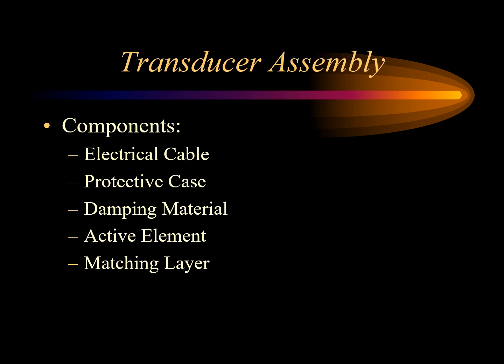Here are some components of an ultrasound transducer that will be briefly discussed on the next few slides. Transducers will be more heavily covered in the ultrasound physics course.